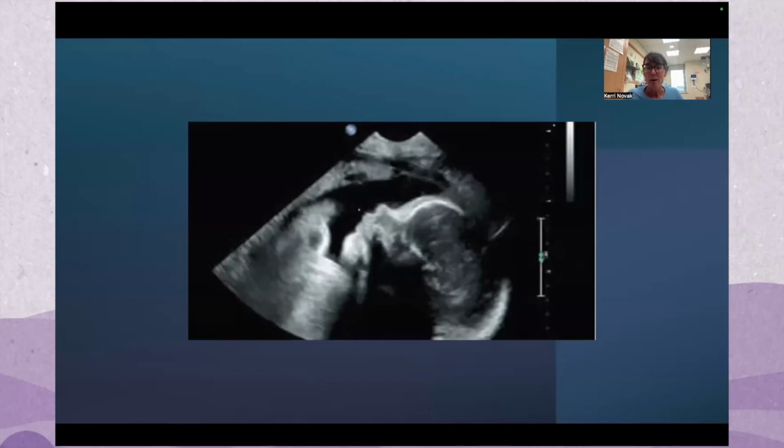Many of you are probably familiar with ultrasound. Maybe you yourself have had an ultrasound. Maybe you've had a baby, or you know someone who has. Ultrasound has not typically been used for the bowel, but for looking at other things like the kidneys, the liver, maybe even ovaries, prostate, and certainly the fetus.